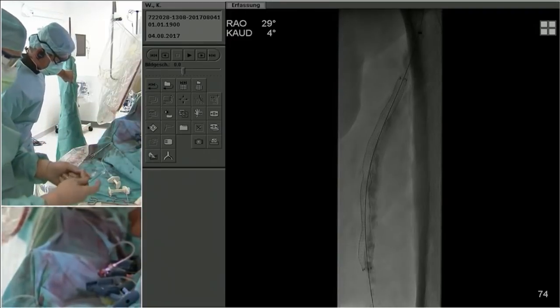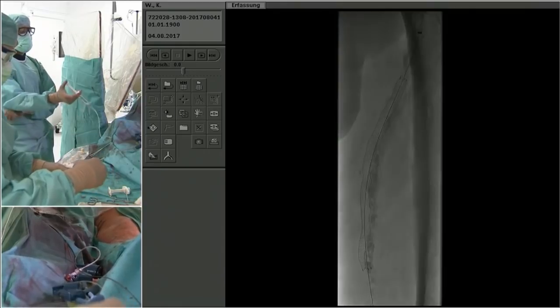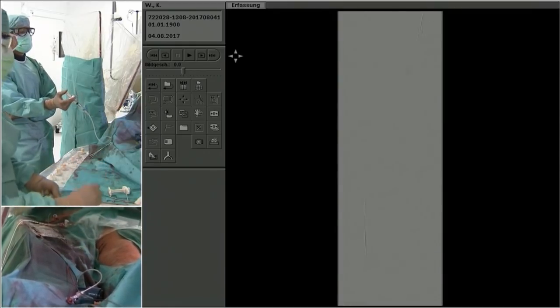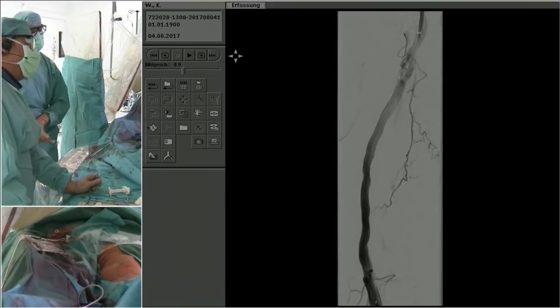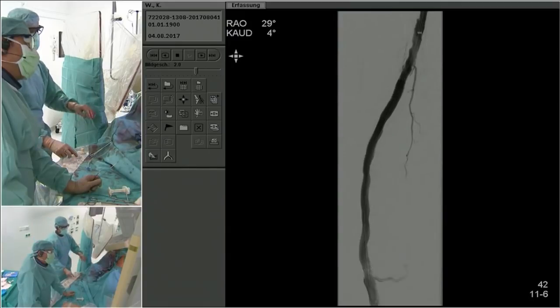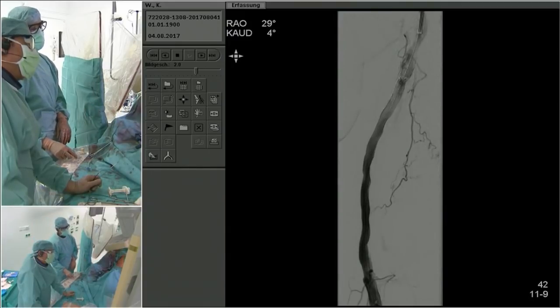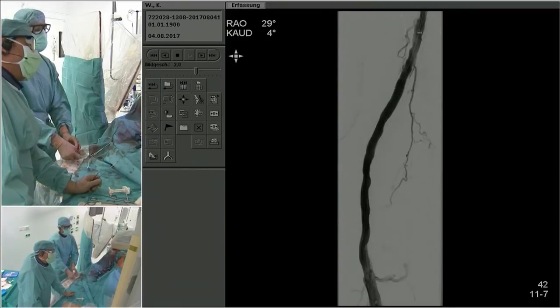These are some open questions which we also have, of course, still. So the question is, how much radial force will Supera have in this heavily calcified lesion to prevent this recoil? So with just a show of hands on the panel, how many of you will just leave it the way it is and accept what Andrej's question? So we have 2 out of our 7 panelists, 3 now.